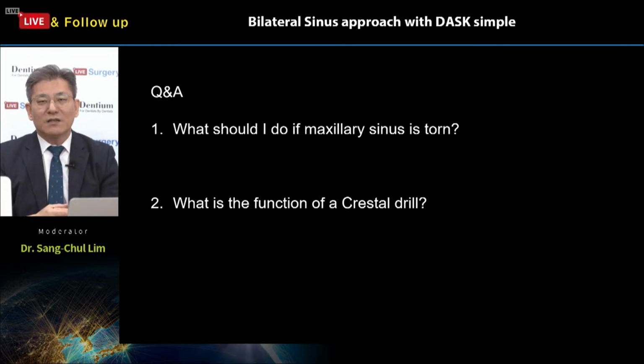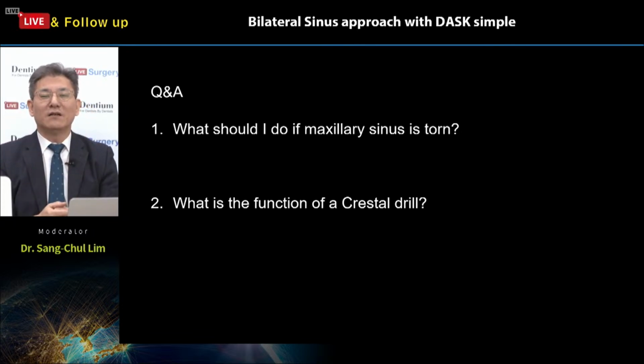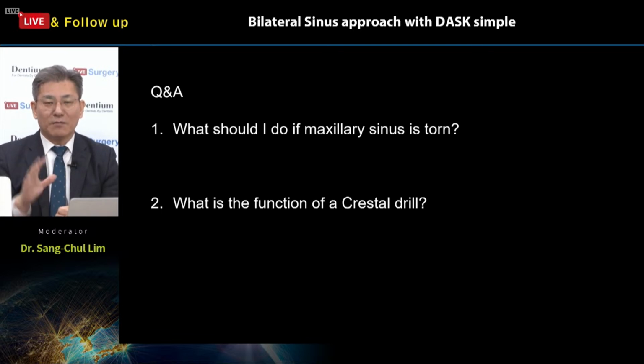So it is another benefit when you use this crestal drill, right? The squeezing, compacting, and making a bone chip into the sinus floor. All these procedures happen automatically just using the crestal drill at 50 RPM, a low speed, right?